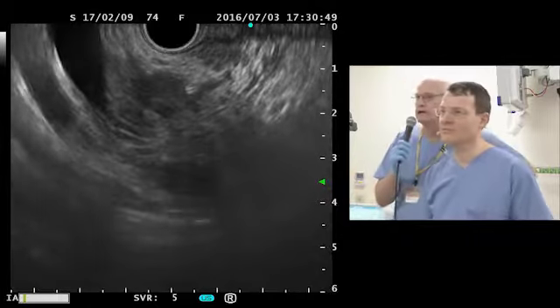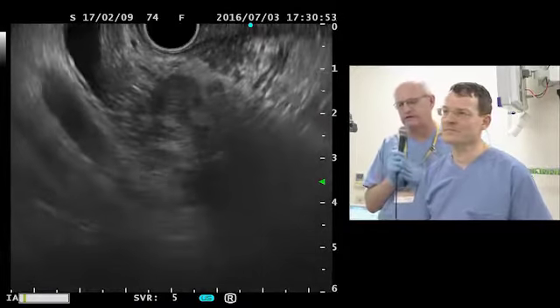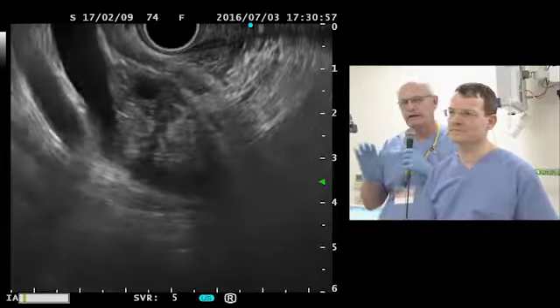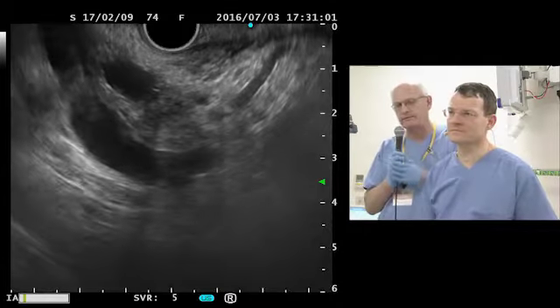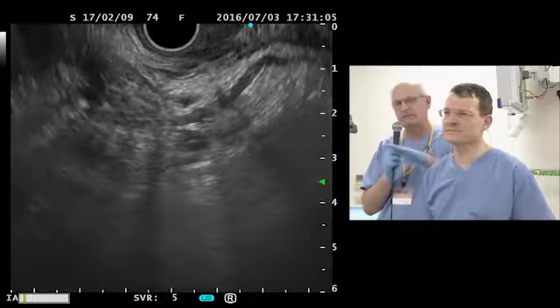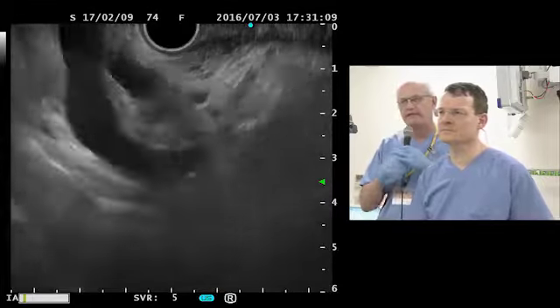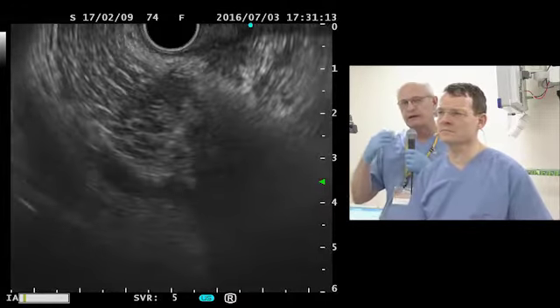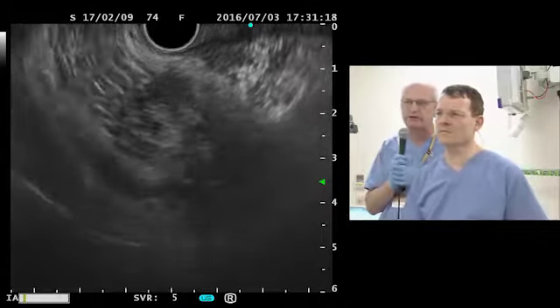What would you say, Rob? Yeah, so Haru, it is very, very typical for these lesions to be very well differentiated. So the conundrum for the pathologist is: is this atypical? Is it well differentiated adenocarcinoma? For our immediate read, this would be very typical. What I typically hear when I do this kind of lesion.